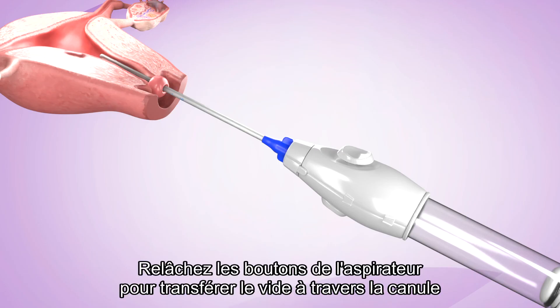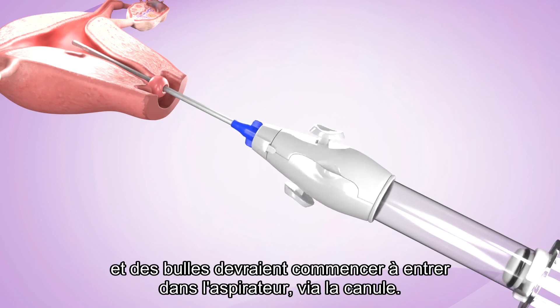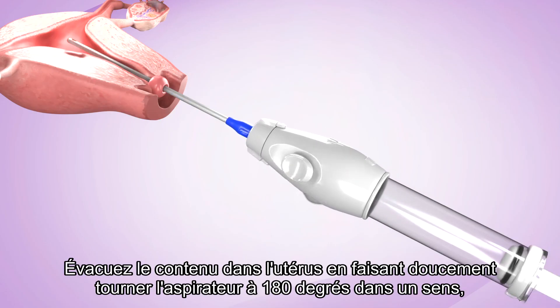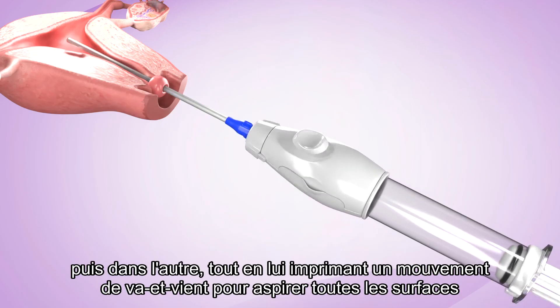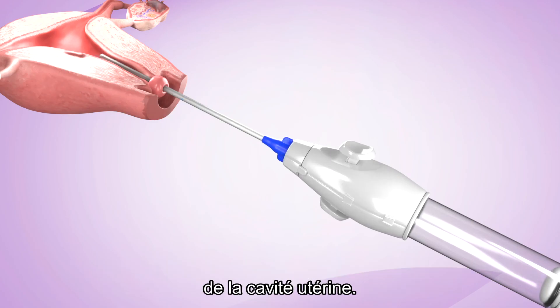Release the buttons of the aspirator to transfer the vacuum through the cannula into the uterus. Blood, tissues, and bubbles should begin to flow through the cannula into the aspirator. Evacuate the contents of the uterus by gently rotating the aspirator 180 degrees in each direction, while using a gentle in-and-out motion to cover all of the surfaces of the uterine cavity.